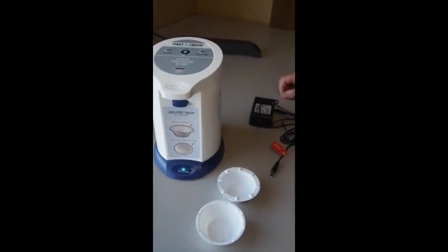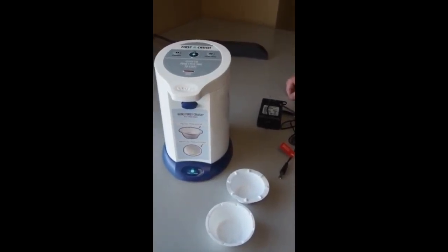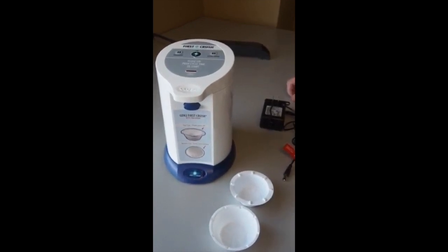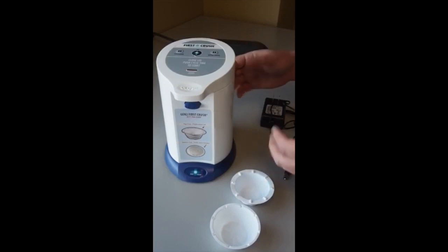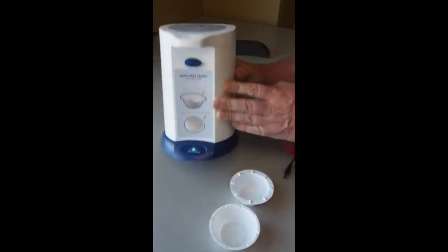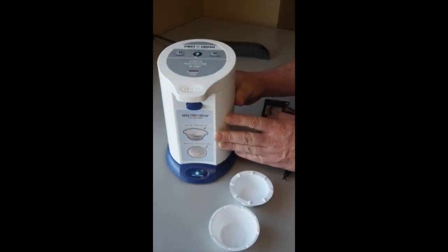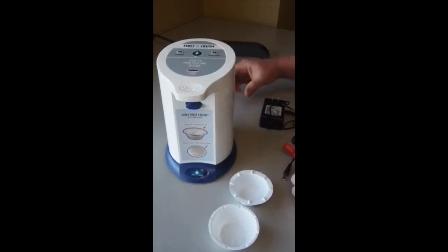Hello and welcome to the First Crush automated pill crusher in-service video. Our system includes not only the automated pill crusher, but also a power cord and a required set of consumable cups. The First Crush automated pill crusher here uses a rechargeable battery.